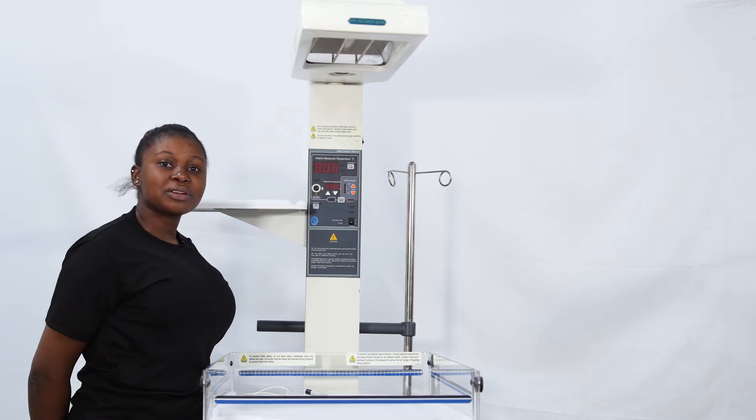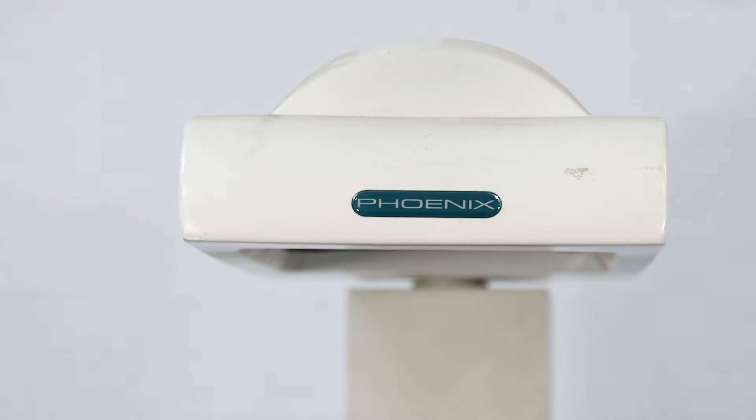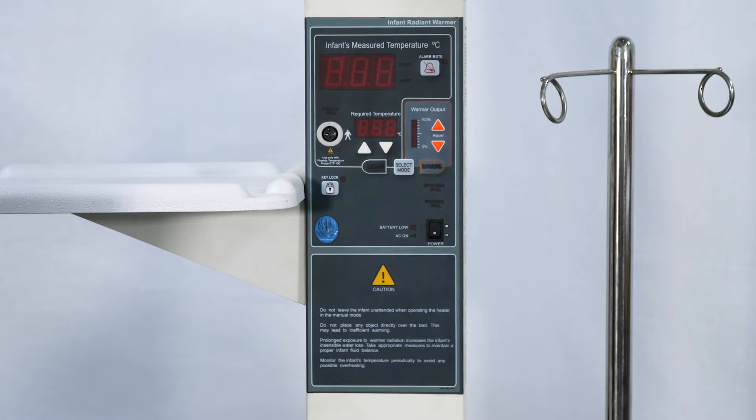Hello everyone, I'm here to talk about the Phoenix Radiant Warmer. The Phoenix Radiant Warmer works on the same principles as the Wallaby model, although a few specific controls differ slightly.